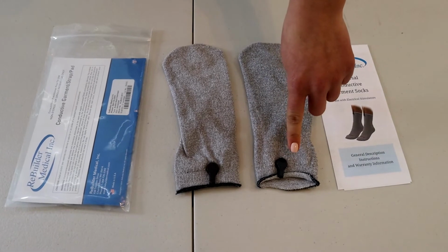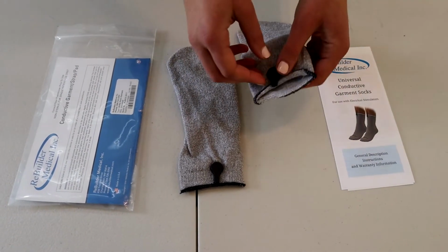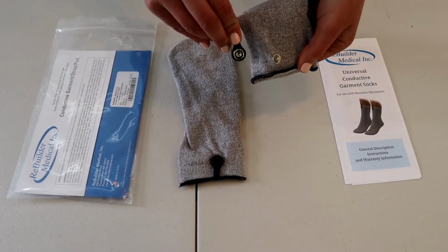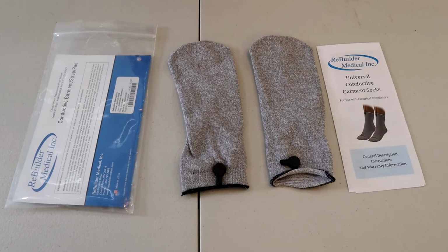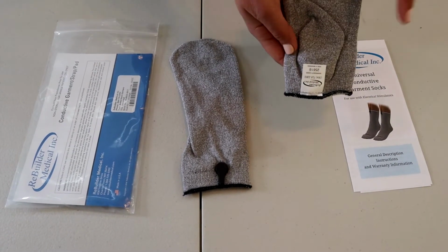You will find the snap connectors on each of the socks. This is where the lead wire will be plugged into for treatment of your ReBuilder. The snap connectors can be easily removed from the socks and reattached. Snap connectors' color and shape may vary. On the other side of the sock, you will find your warranty tag.